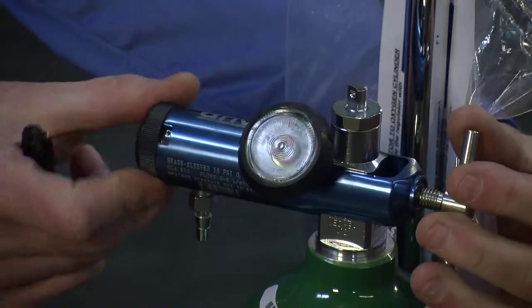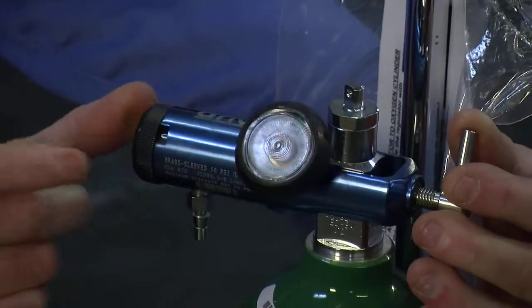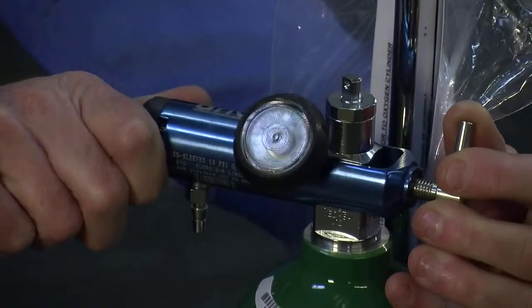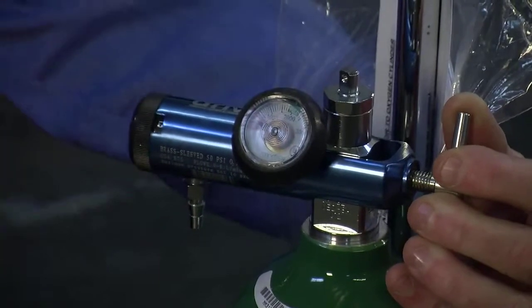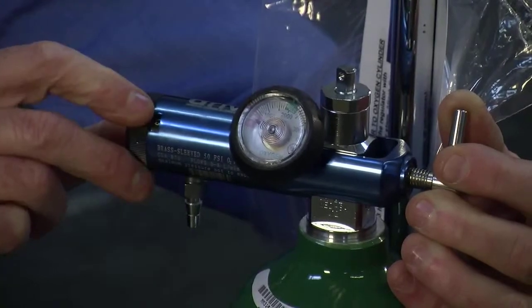From there we move to the flow selector, which starts at zero and can go up to as high as eight liters a minute. You would only use this as prescribed by your doctor, and you would set this on the number that your doctor has requested.